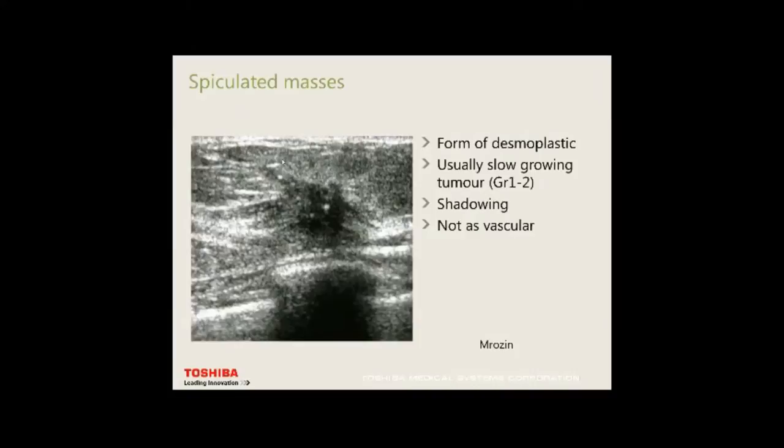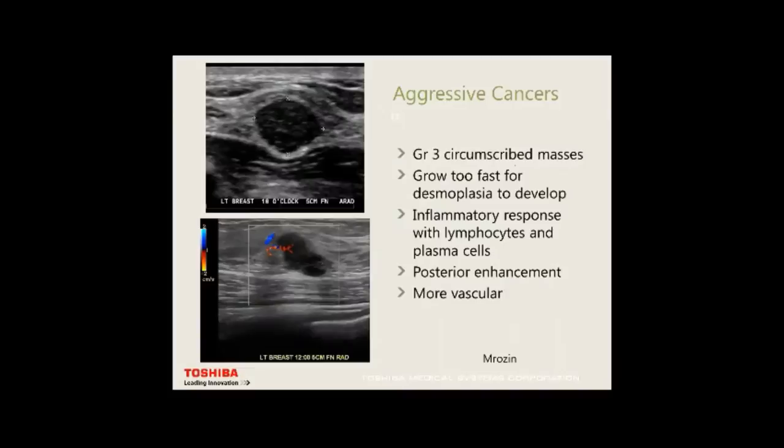You can see the desmoplastic reaction and spiculated masses around these lesions — they tend to shadow. Grade 1 and grade 2 breast cancers are the most common types and tend not to be highly vascular, though vascularity is often seen.